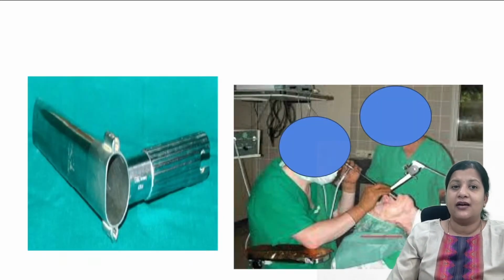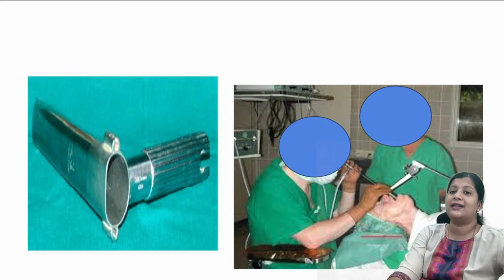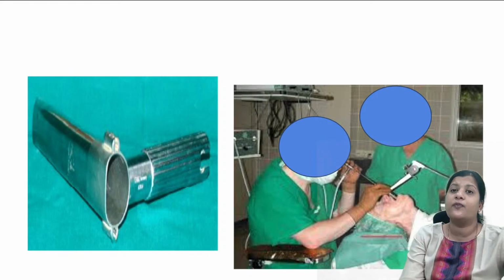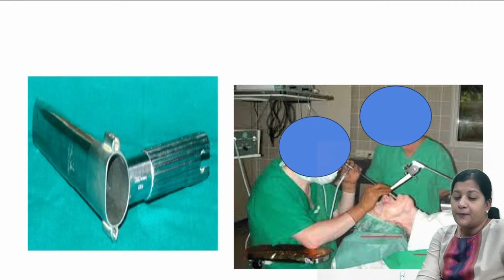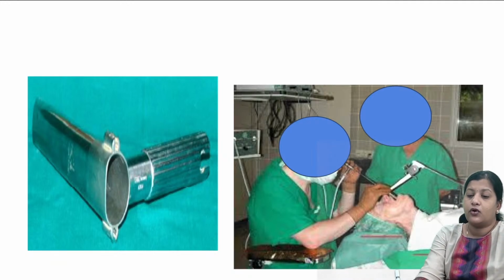So if you see here, this instrument is your Kleinsasser suspension laryngoscope, which is used for all the vocal cord surgeries. So what do we do here? You see here, this is the laryngoscope that is going to be inserted via the mouth of the patient, and this will go onto the larynx. So this part of the instrument is going where? Via the mouth. It is going and getting stabilized on the larynx. Now the other part of the instrument is kept.